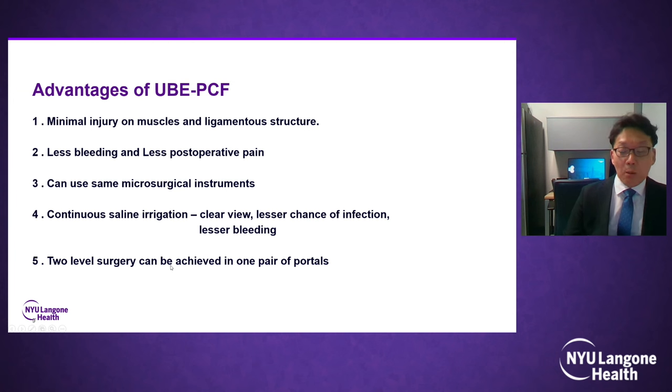And unlike lumbar biportal surgery, in cervical biportal surgery, we can do two-level surgery in one pair of portals because cervical structures are smaller than lumbar structures, and the space between levels is very narrow. So we can approach two levels in one pair of portals.